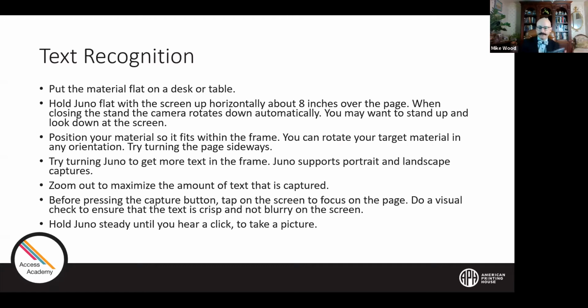So if you're using it with the reading stand open and you're just sitting it on top of a document, zoom out as far as possible to get the most amount of text on the screen. Again, if you want to scan in an entire page of text, it's best to hold it above that page.